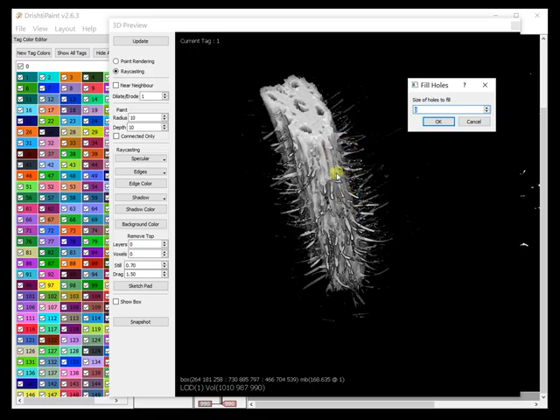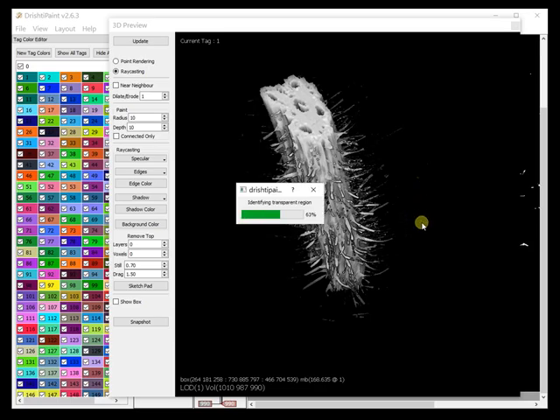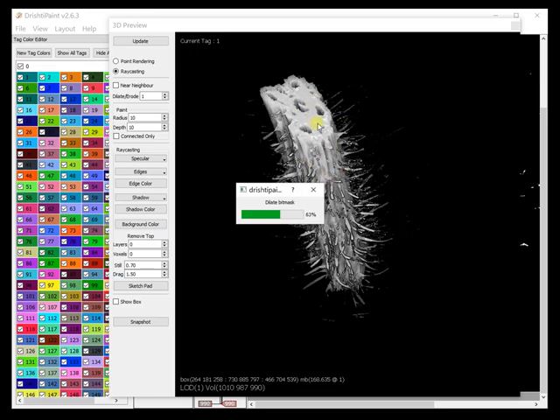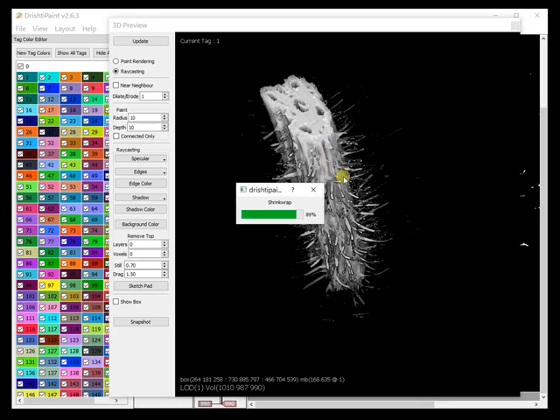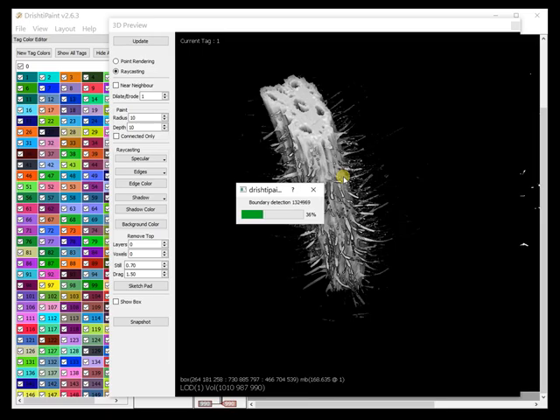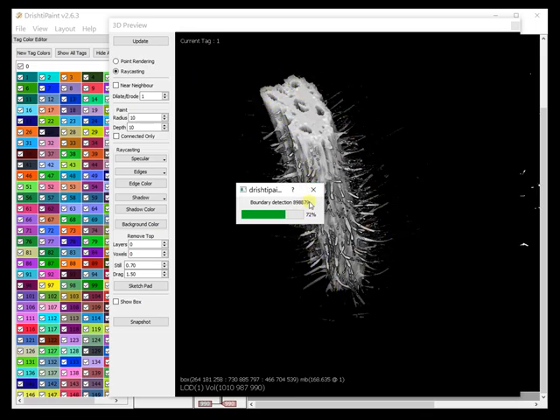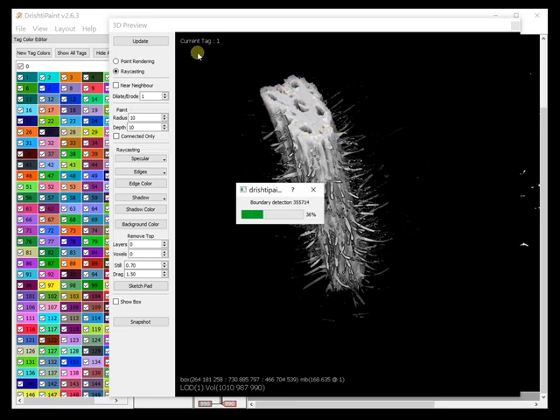There are probably no holes in this stem here but just to be sure let's say fill. If there are any tiny holes then let's just fill them before applying the shrink wrap. What's happening here is it is first detecting all the visible region of the stem and then dilating the bit mask, dilating this visible region to close off the pores. In this case we say close the pores which are at most size three voxels radius. Then it will start from the boundary and it will shrink wrap to this region and everything that is within this region will be tagged as one. All these empty regions here will also get tagged with tag one.